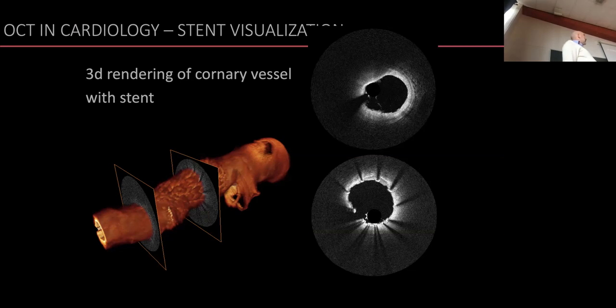And I like to tell this, but we did this, I would say 7-8 years ago. And we were quite proud that we were able to achieve this, also the 3D visualization. But what you see maybe in this 3D visualization again, there is this movement artifact, breathing or heartbeat, but it's there.